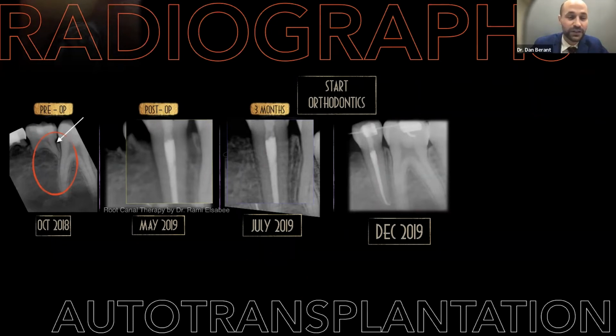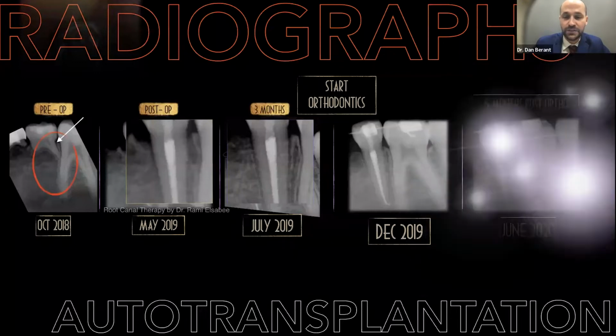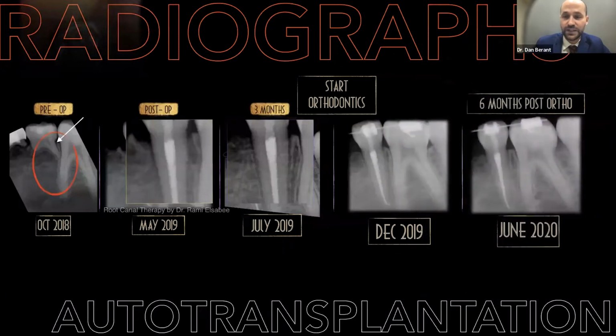And since we already determined that she needs orthodontic therapy, at 6 months, we put the brackets and we wanted to introduce mesial root torque. And so you can see here, after 6 months, when we updated her PA, we can see how the crestal bone has leveled off and also that the root apices have moved in a mesial direction.